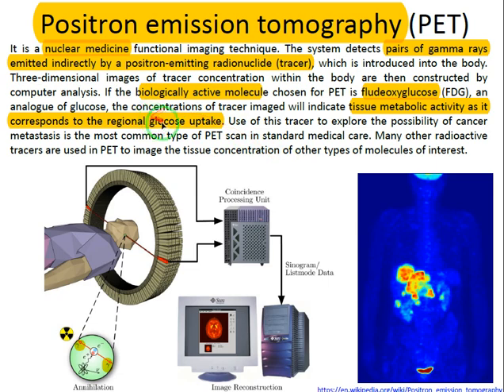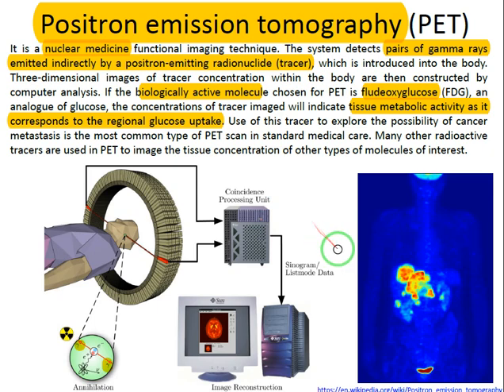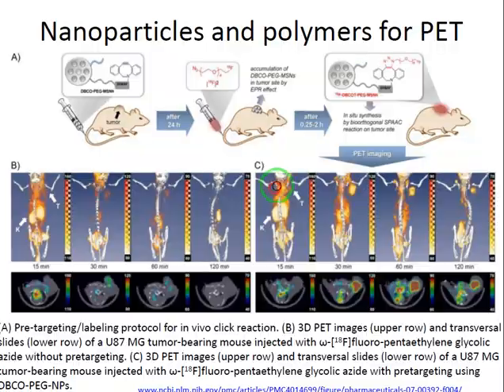For example, we need glucose, or some other nanoparticles to take them and deliver them into the tissue. Just remember that linking the nuclides onto glucose or the vehicle or whatsoever needs a chemical reaction. So it would be time consuming, energy consuming, and so complicated.